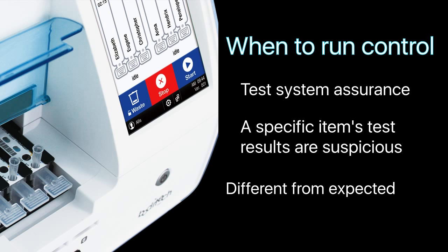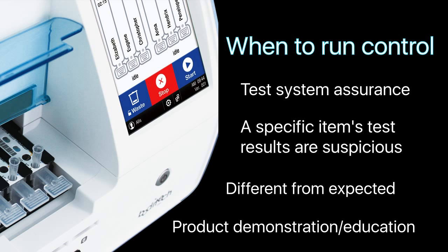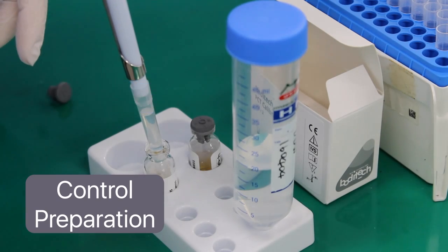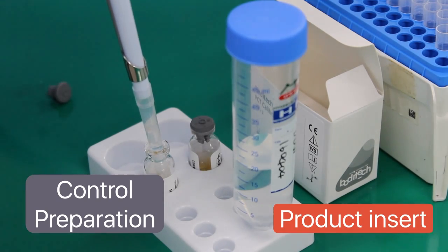Controls are also recommended when results are far different from the expected result value based on patient symptoms, and for educational or demonstration purposes of the AFIA system. Reconstitute the control following the preparation instructions on the product insert.